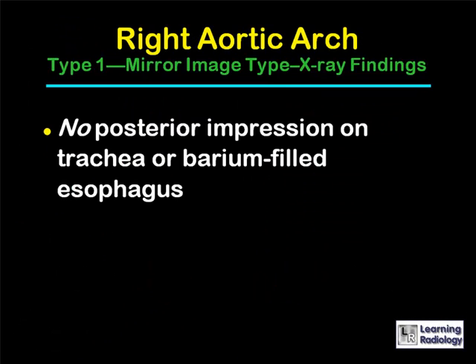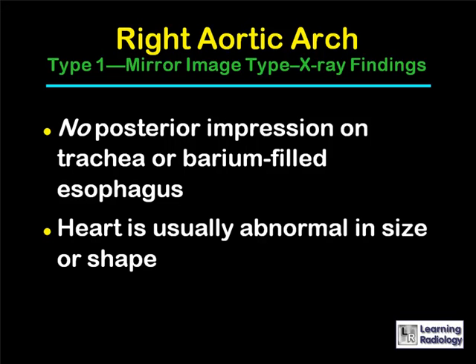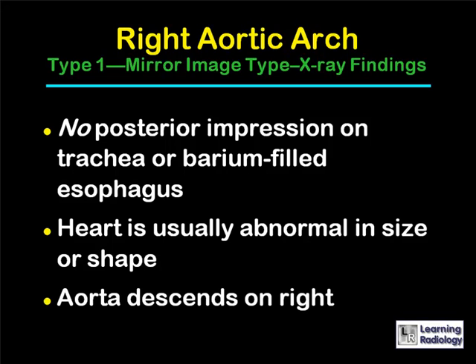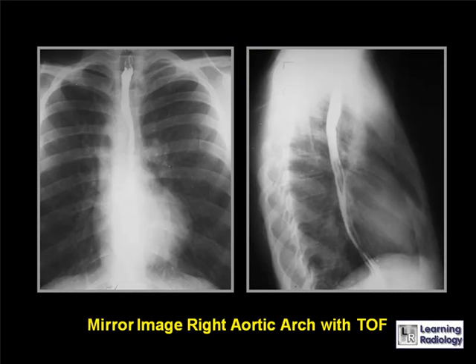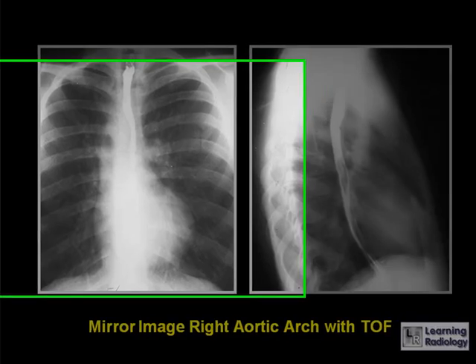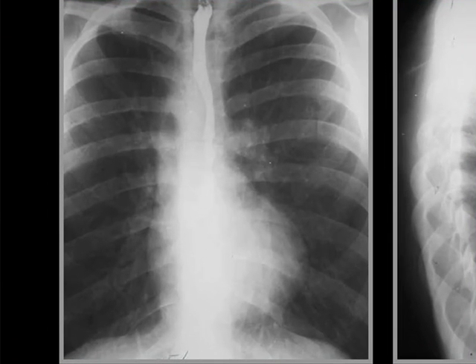There is no posterior impression on the trachea or the barium-filled esophagus by a mirror image aortic arch. The heart is usually abnormal in size or shape because of the presence of congenital heart disease, and the aorta descends on the right. This is an example of a mirror image right aortic arch in a patient with tetralogy of Fallot — an adult. You can see that the arch is on the right side and displaces both the barium-filled esophagus and the air in the trachea toward the left. The heart has an abnormal shape produced by elevation of the apex by right ventricular hypertrophy.